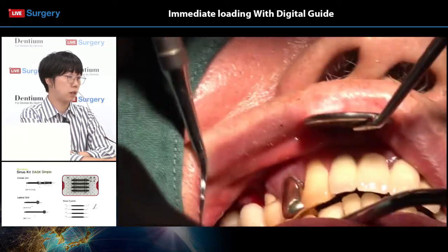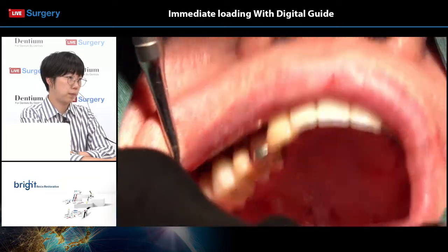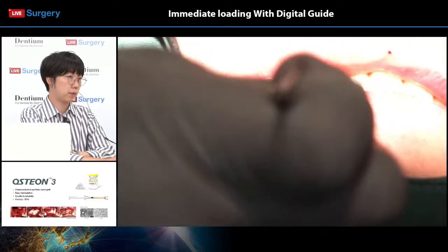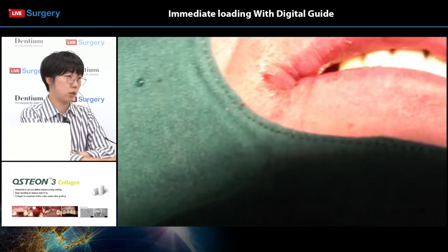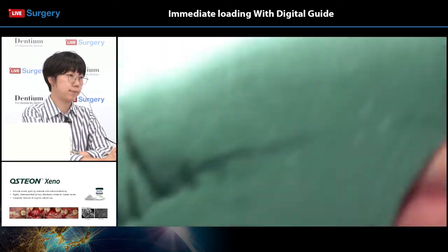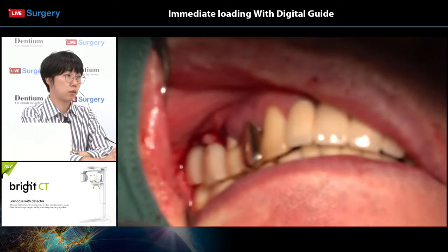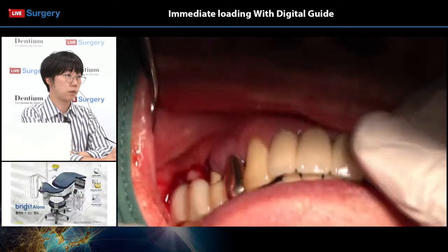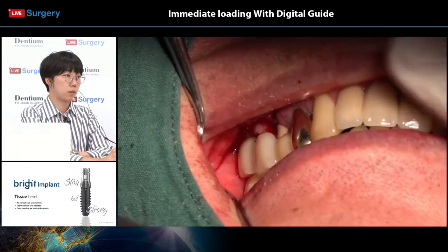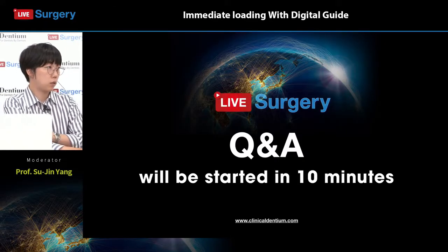Okay, the crowns are very well set into the patient's mouth. Dr. Lee is checking on the occlusion and the lateral guidance. Okay, so Dr. Lee has just finished his surgery.